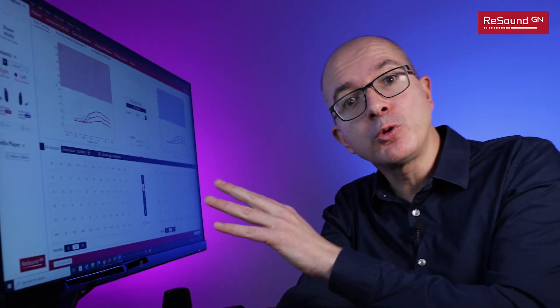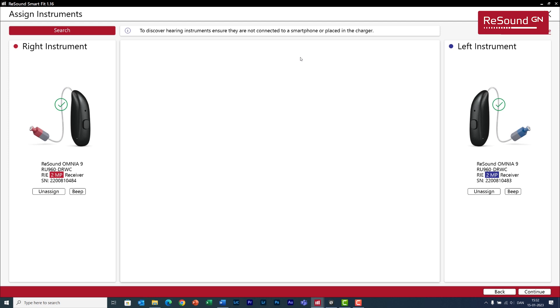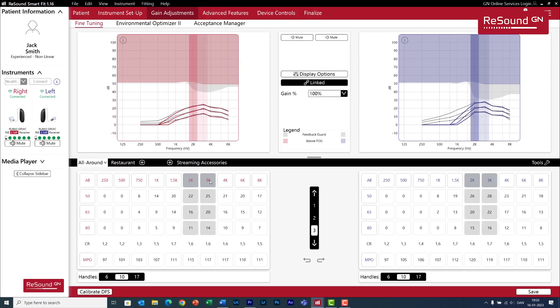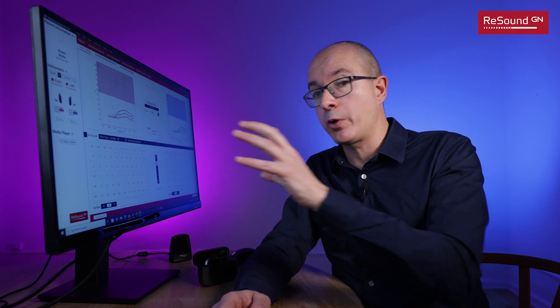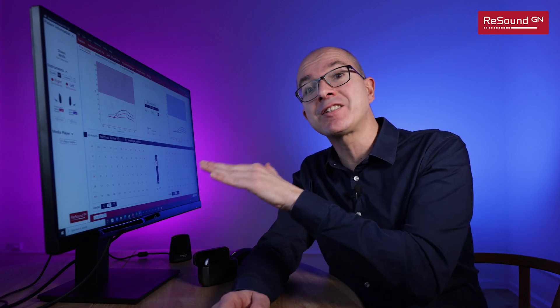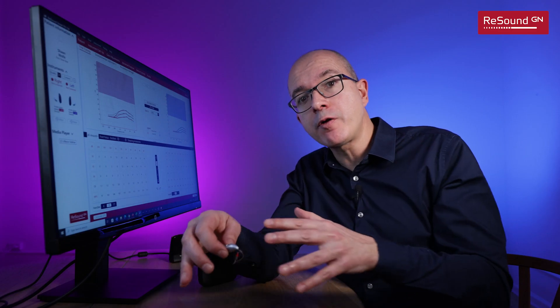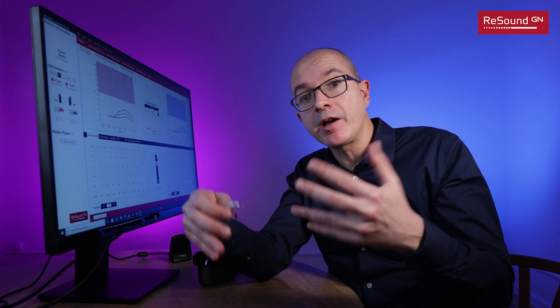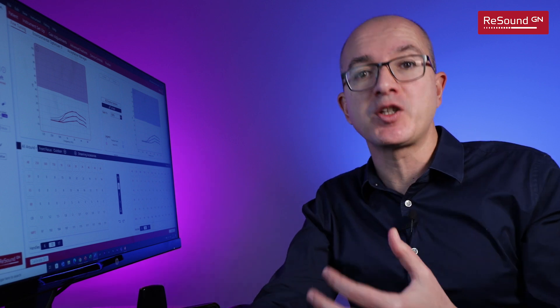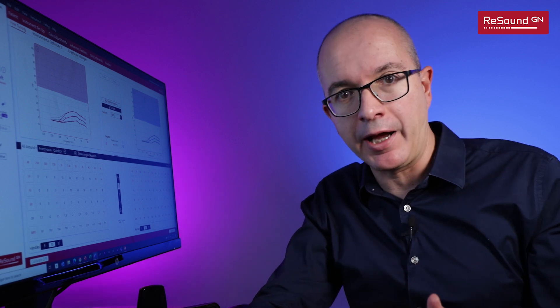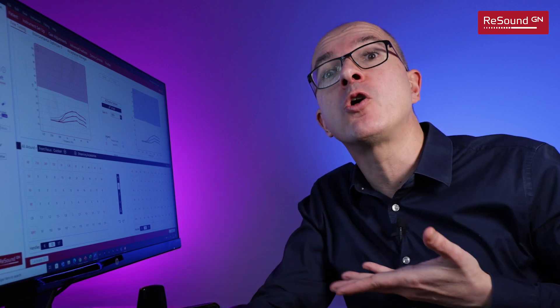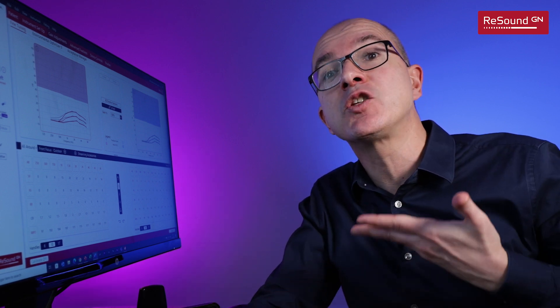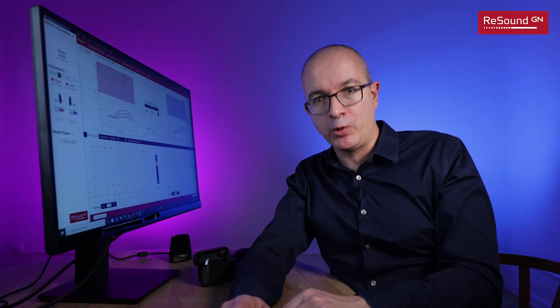In this video I'm going to show you how easy it is to do a first fit with ReSound SmartFit, and we're going to use the latest version 1.16. You will see how ReSound SmartFit is designed to give a fully personalized experience to your clients with a particular focus on enhancing speech clarity in background noise.